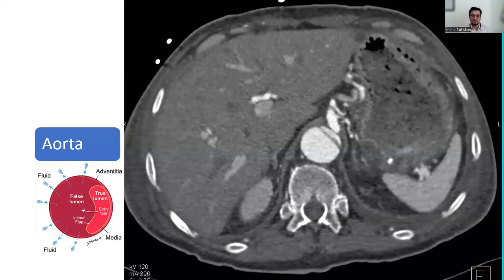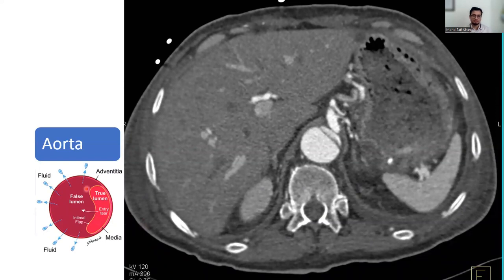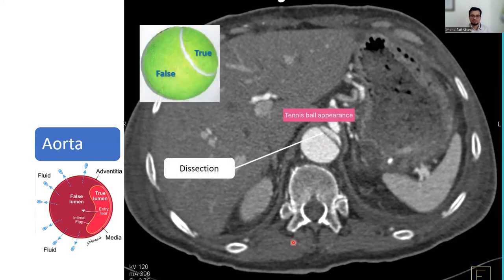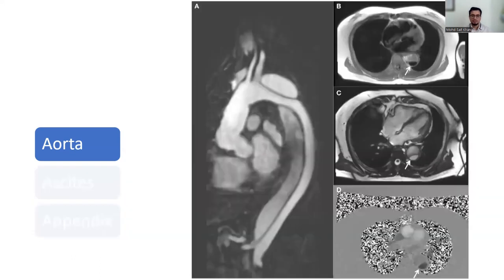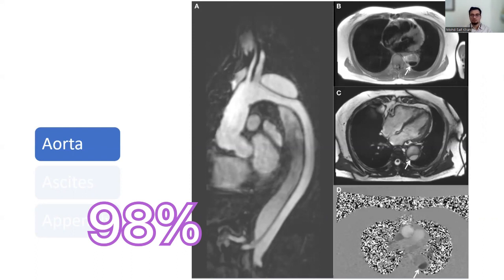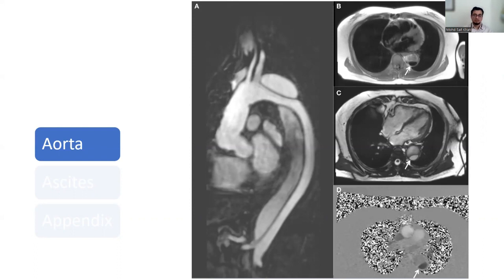Aortic dissection is another problem. The intimal flap is raised, creating a false lumen which is usually larger than the true lumen — giving a 'tennis ball appearance' on CT. The true lumen is smaller and the false lumen larger, typical of aortic dissection. Currently, aortic dissection is most reliably detected on MRI, which is the gold standard with sensitivity and specificity of about 98%.